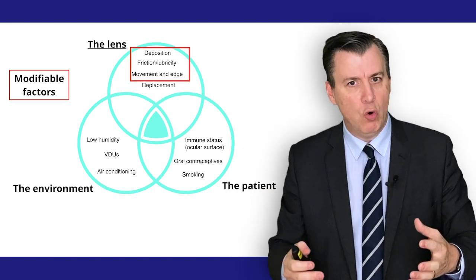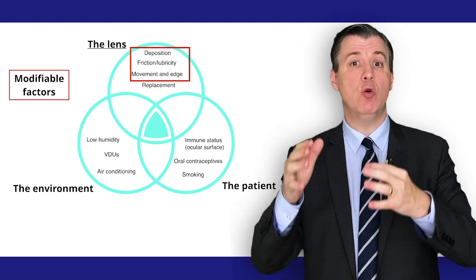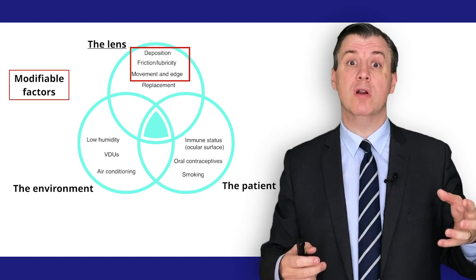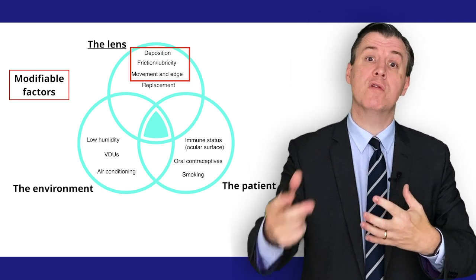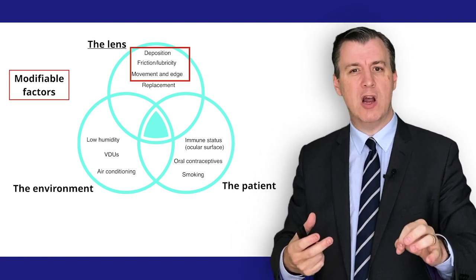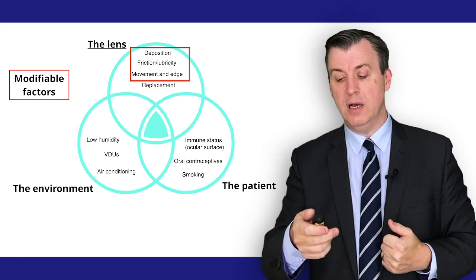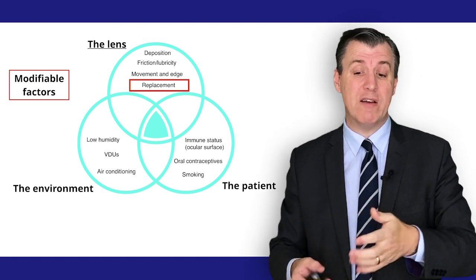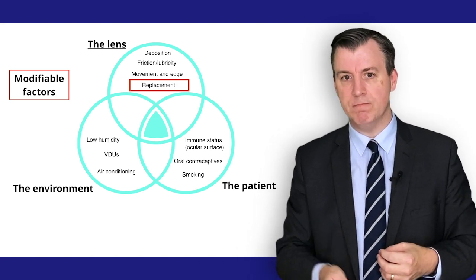So all of these things seem to be important, but we don't really have the option with modern soft lenses to order a lens that's the same in all respects apart from this one feature. We can't really order the same lens brand, but please can you supply it to me with a different lens edge, for example, or the same characteristics but that moves less. But what we can do perhaps is look for a different brand, change the brand, be proactive, do something if there is a sense of discomfort in your contact lens wearer, and you can perhaps identify one of these characteristics as not being perfect, then order a different lens brand. And the same applies also to lens replacement. On the whole, on average, if lenses are replaced more frequently, there is evidence that this leads to a more comfortable situation.